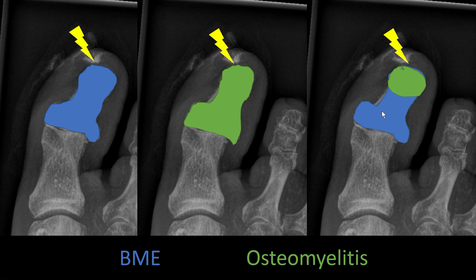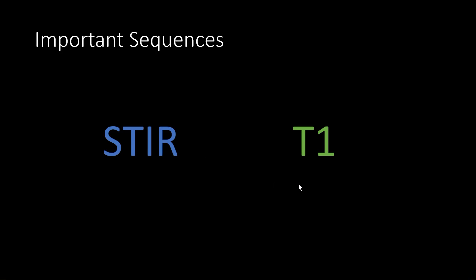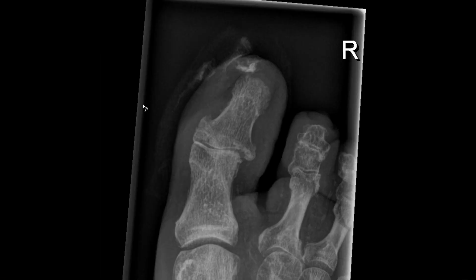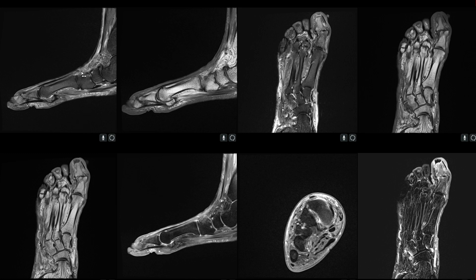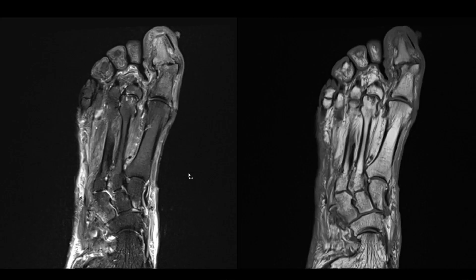Now, how can we differentiate osteomyelitis from reactive bone marrow edema? For this we just need two sequences: the STIR sequence and the T1-weighted sequence without gadolinium. Here is the first patient, an older one. Here is the ulcer and we don't really see any clear signs of osteomyelitis on the conventional radiograph. There are a lot of sequences but the key ones are the STIR and the T1, then the same two sequences in another orientation. Let's start off with the two important sequences.